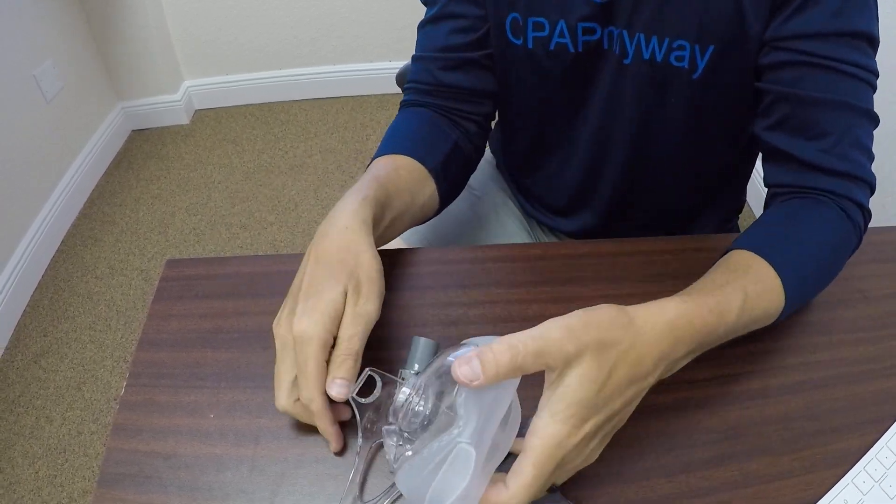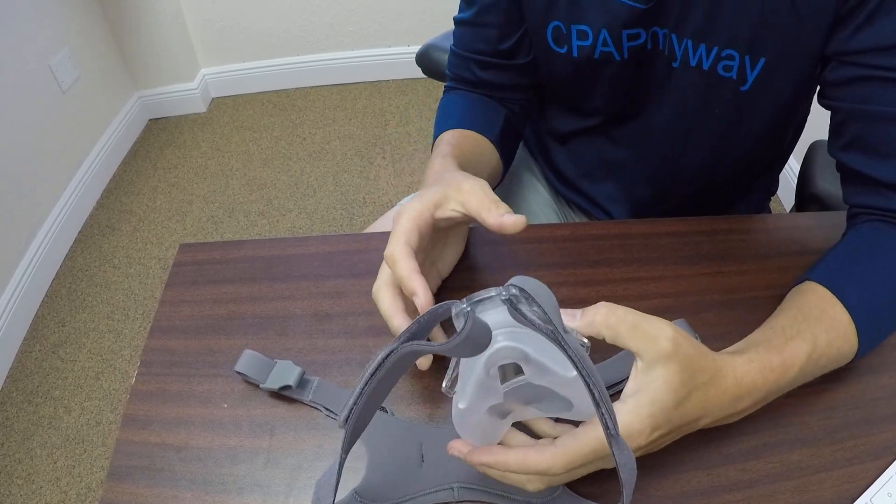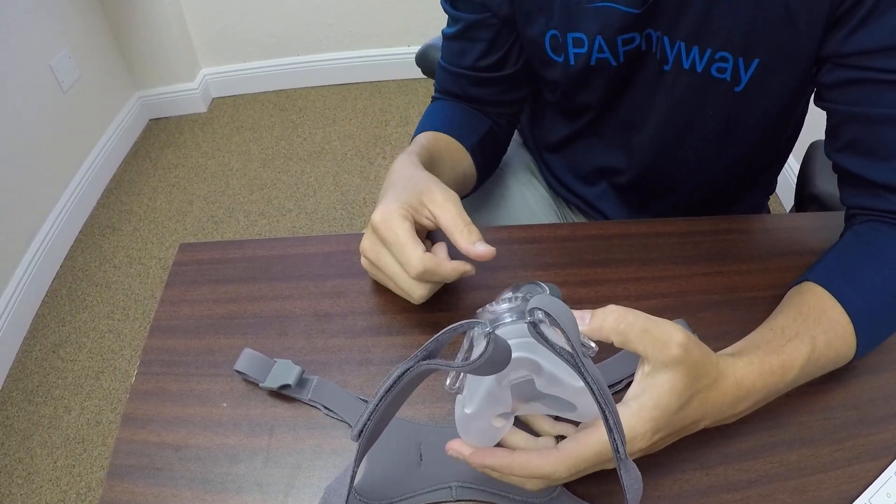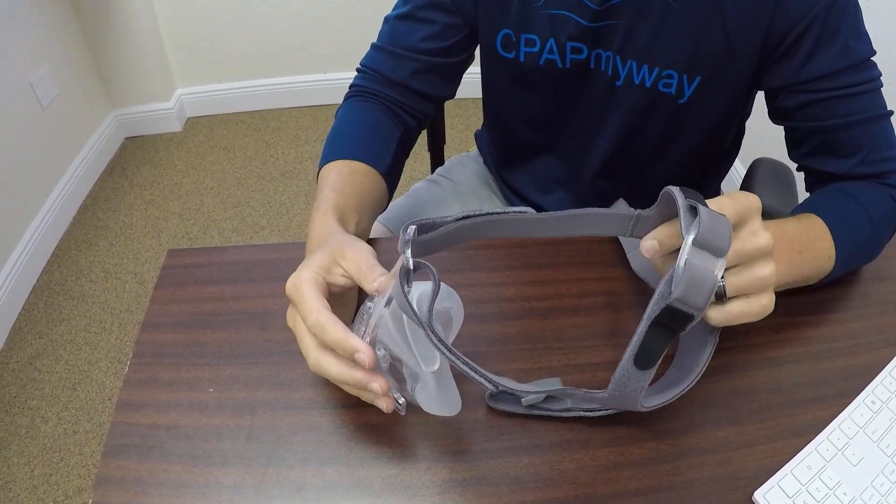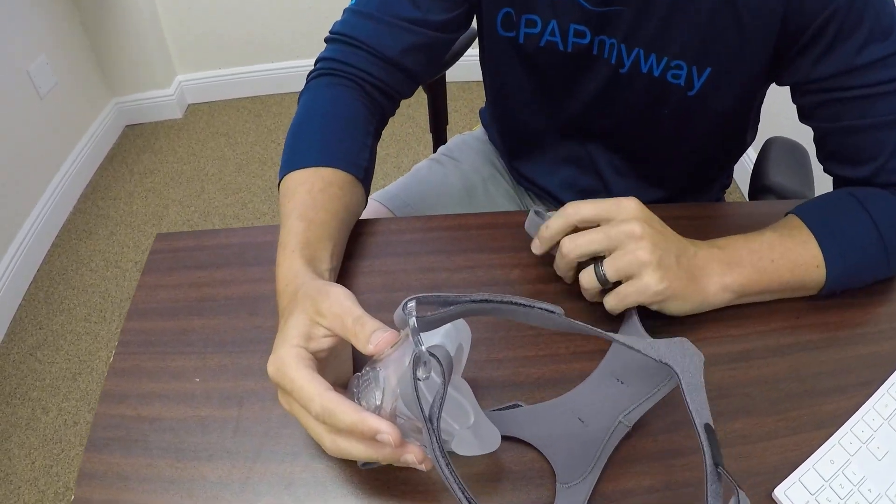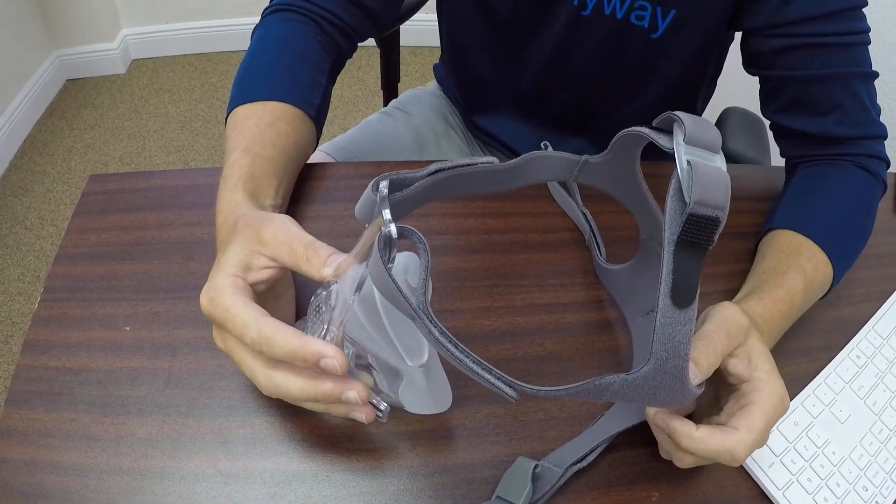They pop on and off very easily, and it has a little gauge that comes along with it. So you can kind of measure between your nose and below your lip to find out which one fits you best. It's a nice mask in the fact that you really don't have to guess what size you are if you're starting for the first time or want to try something new.